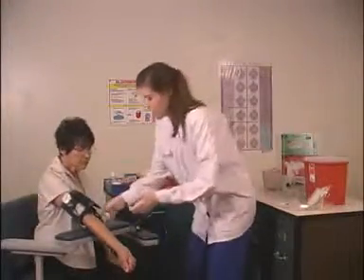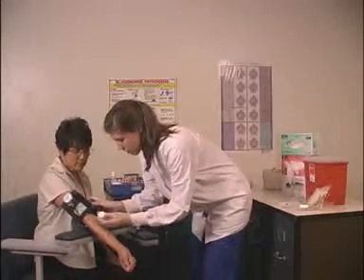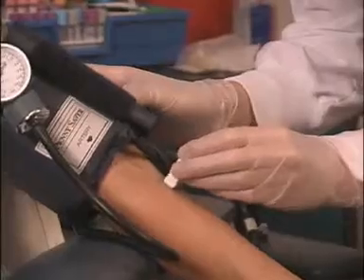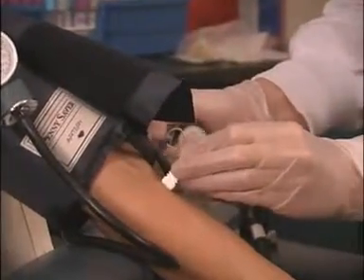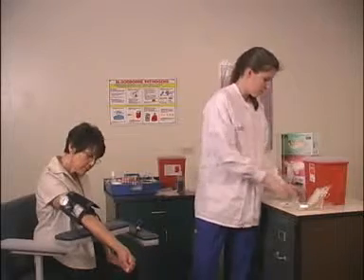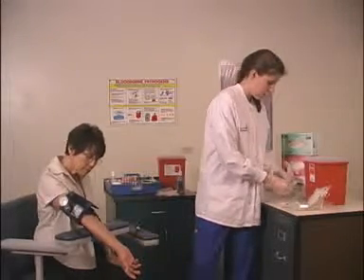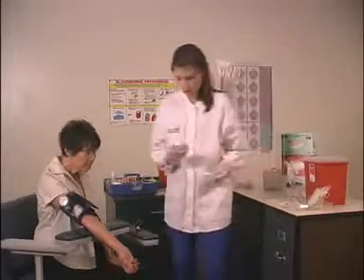Remove the safety clip and place the puncture device firmly on the forearm without pressing. A horizontal incision parallel to the antecubital crease is recommended. Depress the trigger while simultaneously starting the timer. Remove the device from the arm as soon as the blade has retracted, approximately 1 second after the device has been triggered.